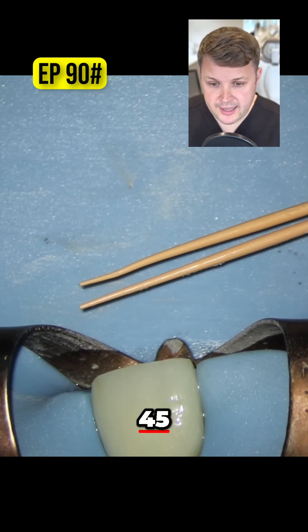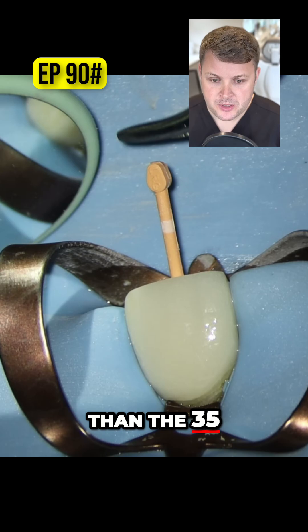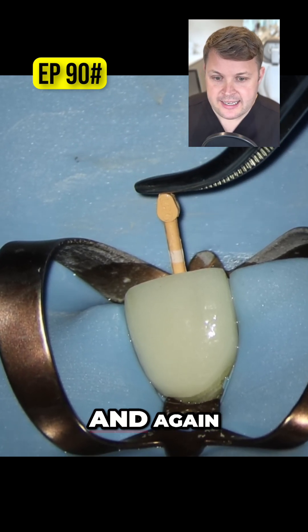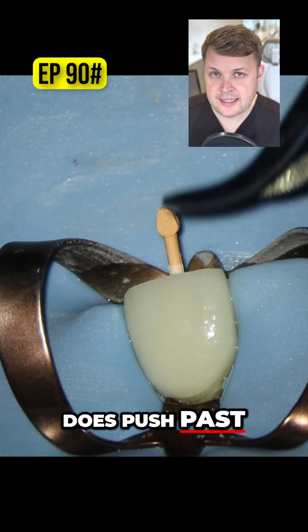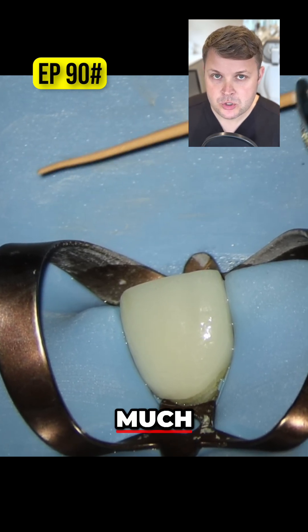I'm going to use a Wave 1 Gold 45, and you can see here that it's just a little bit thicker than the 35. We push it to length, and I notice that it does push past the zero reading on the apex locator, but not as much.